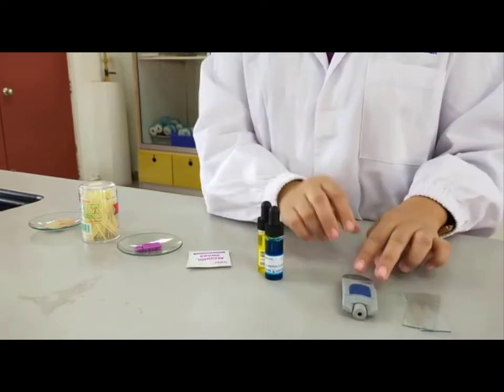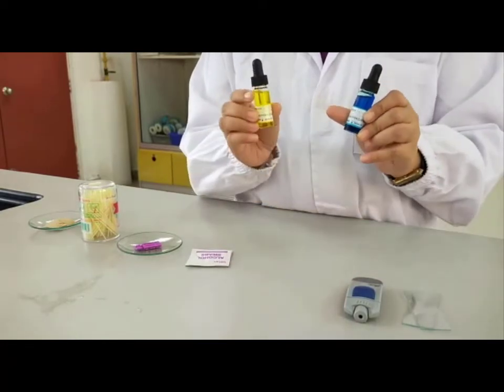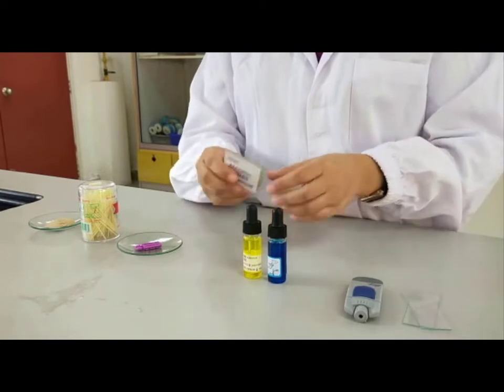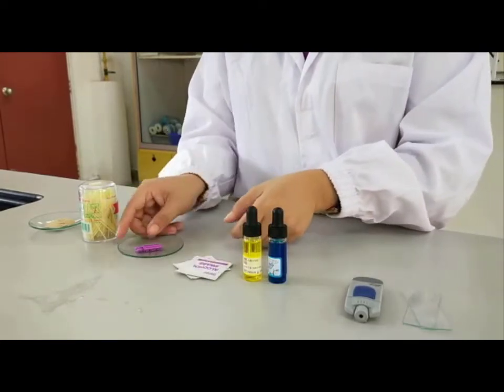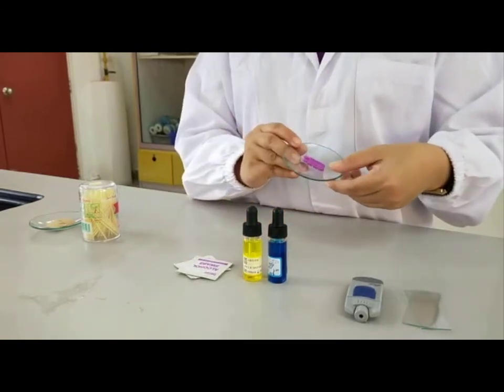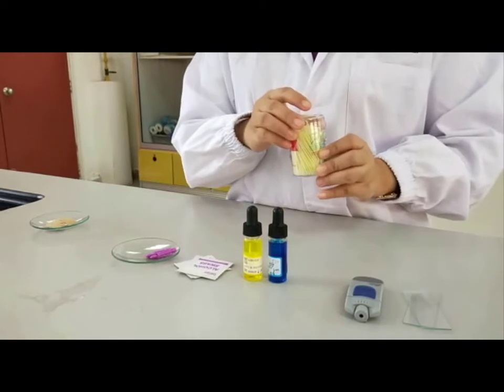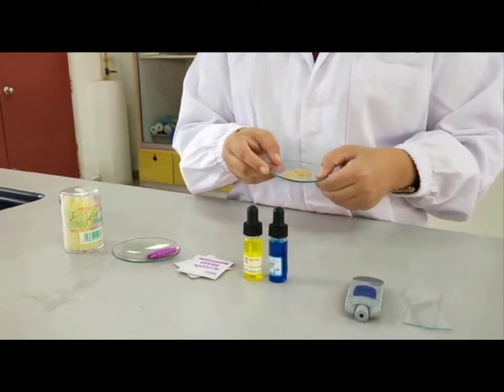For the materials, we start off with the anti-A and anti-B serum, alcohol swab, sterilized lancets, some toothpicks, and a few labeling papers for the slides.